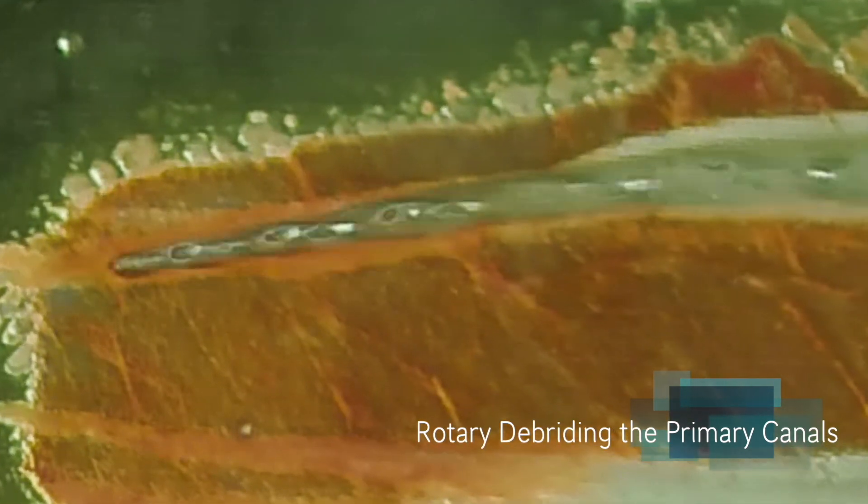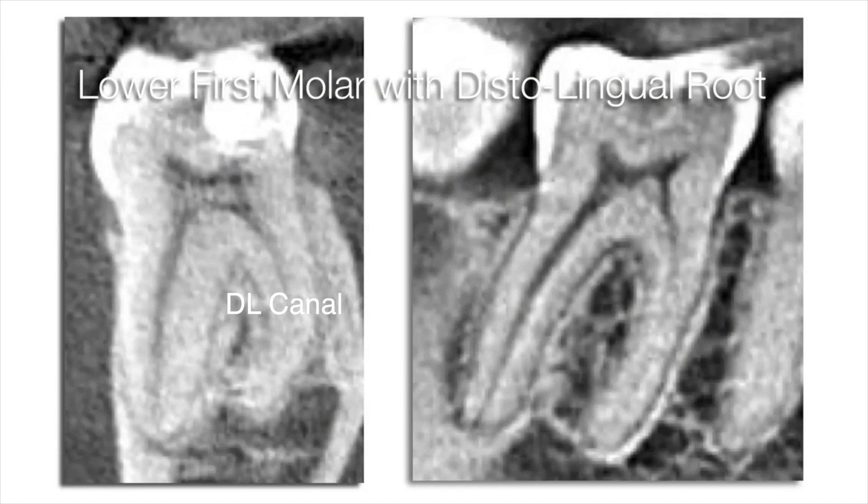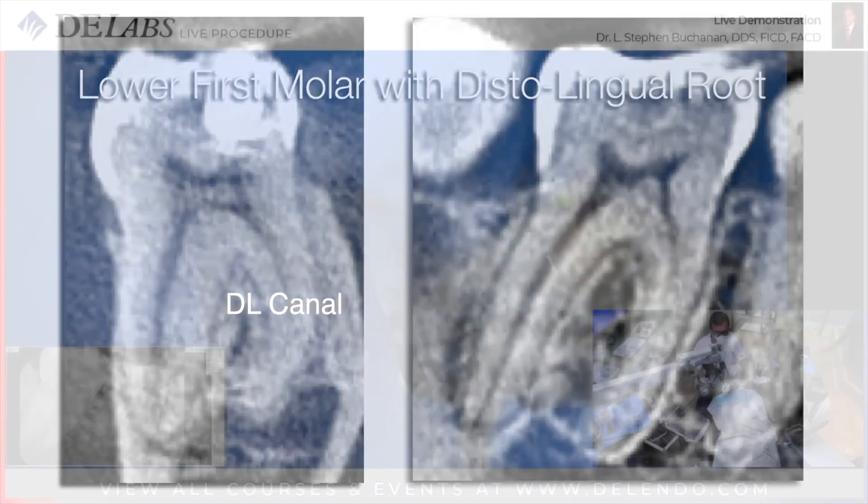That's very interesting because most of us think that rotary files are not the best instrument to take to length as the first instrument. This was a very challenging case due to the severe curvature of the distal lingual canal in its lower first molar, rare.